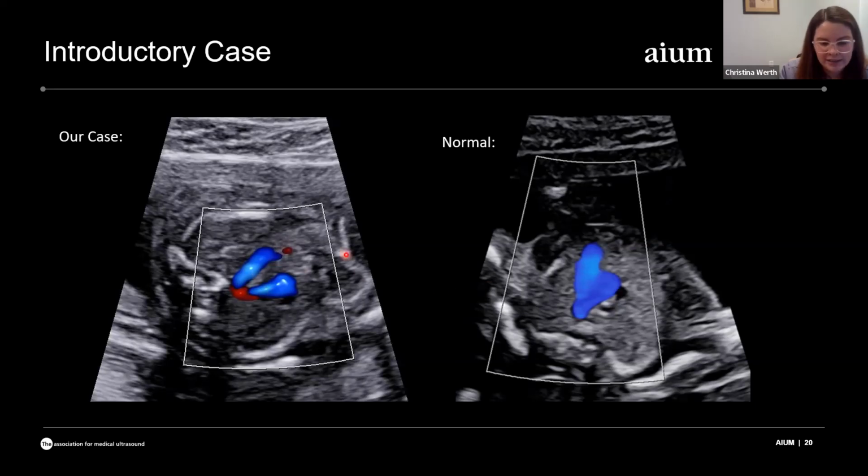And so kind of breaking this down a little bit more closely, we see the trachea here, and we see that the ductus arteriosus is sort of that pulmonary artery is to the left of it, but we do start to see that the aorta is to the right of that in respect to the trachea. So this case does indeed look like a right aortic arch.